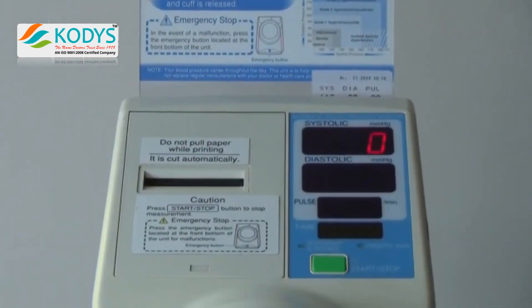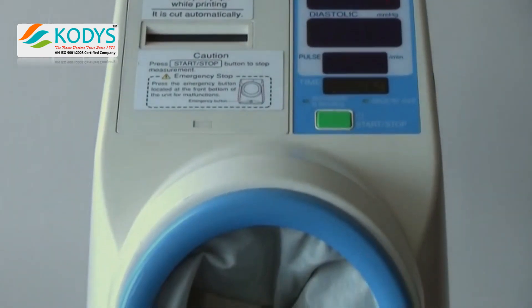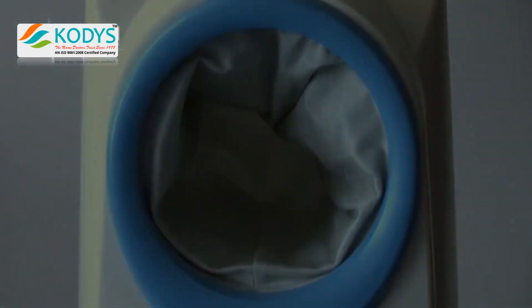The results are then assessed by a member of staff, at which point the patients needing further assessment can be contacted to make an appointment for more detailed investigation.